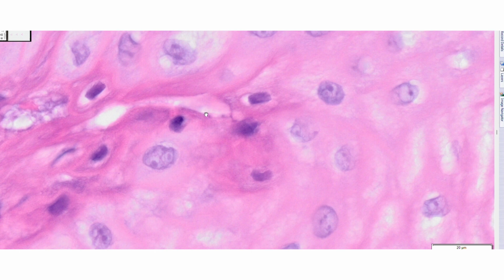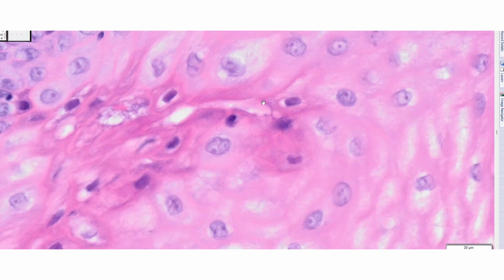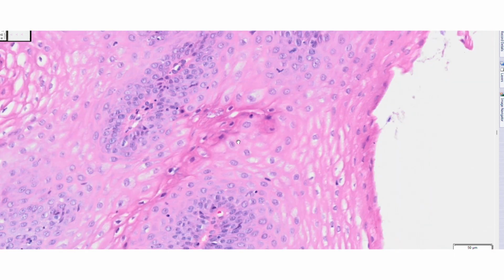I'm not sure if this is a nematode or... I think this would be a diagnostic feature that helps an expert parasitologist to at least get this down to some kind of category of possible species or family.